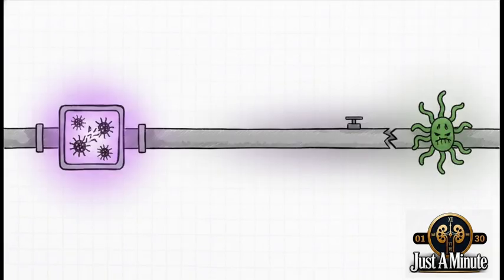I really want to highlight that last limitation because it's absolutely crucial to understand. There is no residual disinfecting effect after the water leaves the chamber. This is not like adding chlorine to municipal water where it travels through pipes killing bugs miles down the road. UV is purely a point-in-time treatment. The very moment water flows out of that glowing chamber and into the dark pipes of the clinic, it is completely on its own. If new bacteria are somehow introduced downstream, the earlier UV treatment offers zero protection against them.